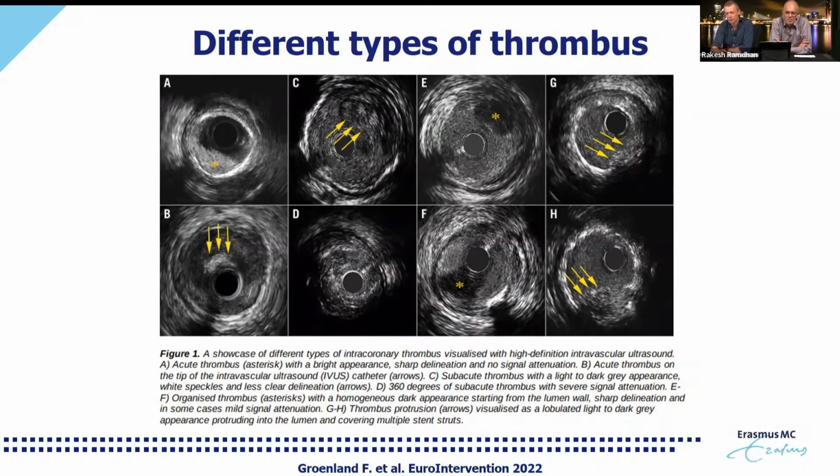So those are the three types of thrombus that you can encounter when imaging patients with culprit lesions of ACS. And on the right side, obviously, an example of a patient with a vessel that was just stented and shows signs of thrombus protrusion, which may happen, of course, if you inflate your stent at high pressures in a soft fatty plaque. That said, Jürgen, any comments, anything to add here?